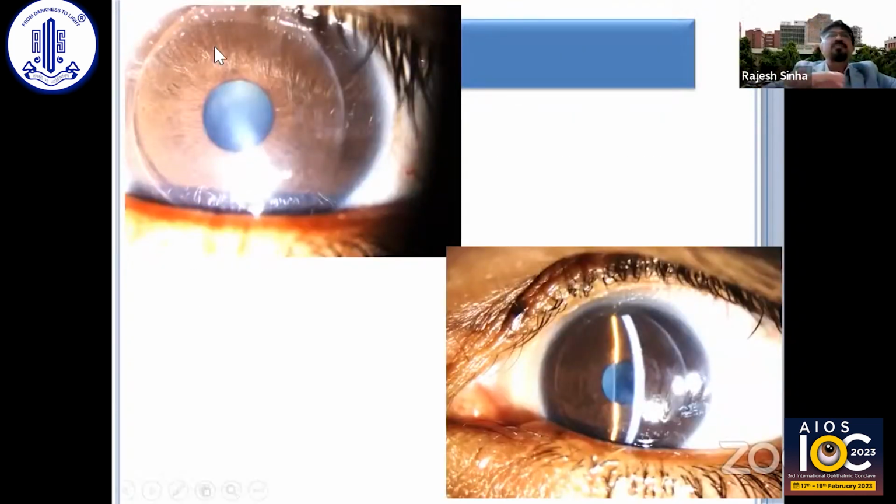You can see this granular dystrophy, how nicely it's a sutureless keratoplasty, no opacity is there. It's almost cleared. You can see 1 or 2 opacities here in the peripheral part, which doesn't carry much significance. So it works quite well.